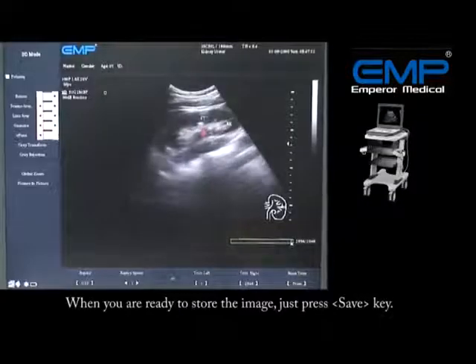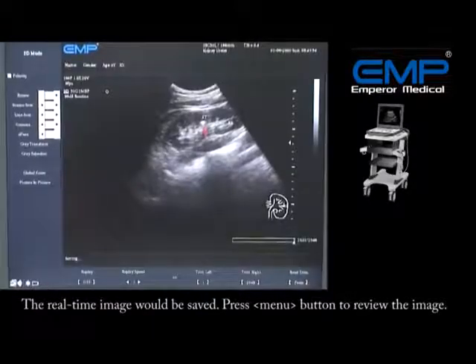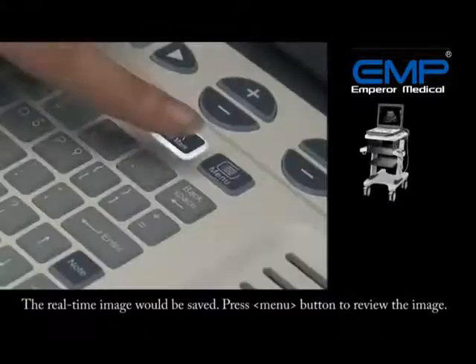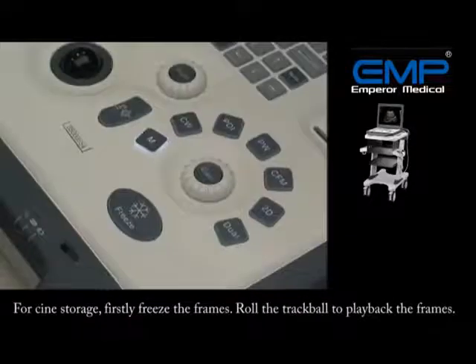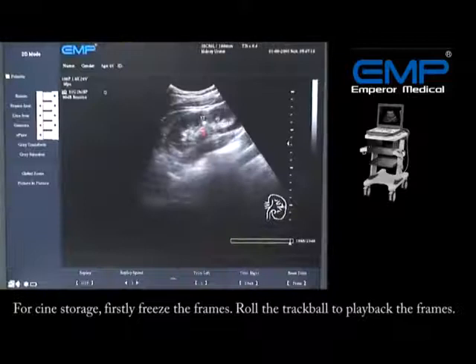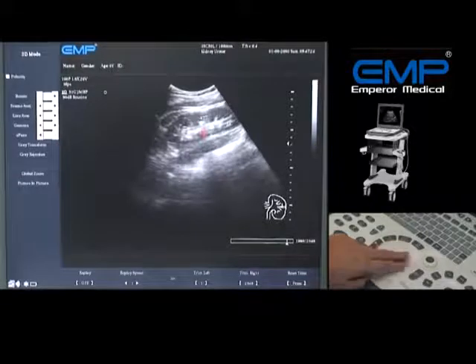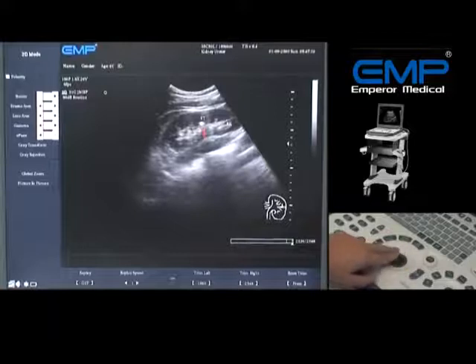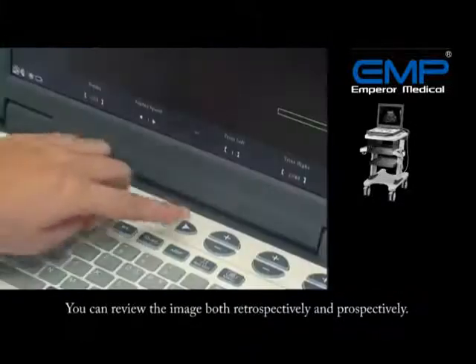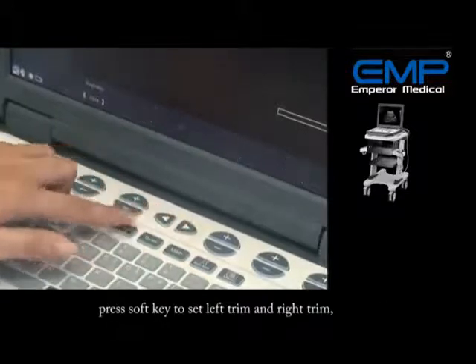When you are ready to store the image, press the Save key. The real-time image will be saved. Press the Menu button to review the image. For Cine storage, first freeze the frames, then roll the trackball to play back the frames — the frame number will change dynamically. You can review images both retrospectively and prospectively. Press the soft key to set the left trim and right trim, then press the soft key again to store the segment Cine.